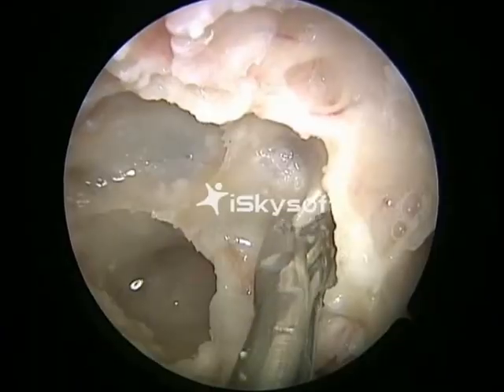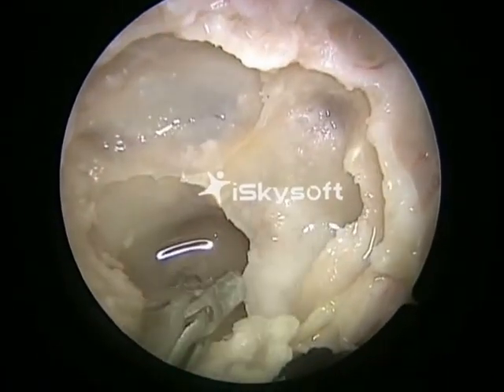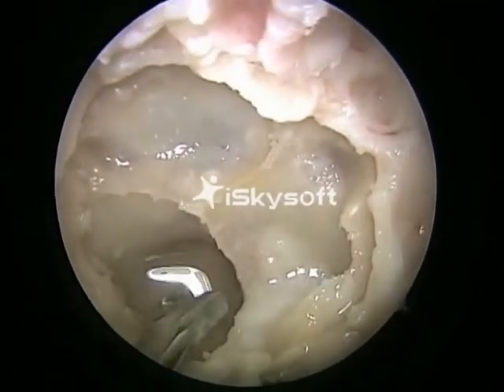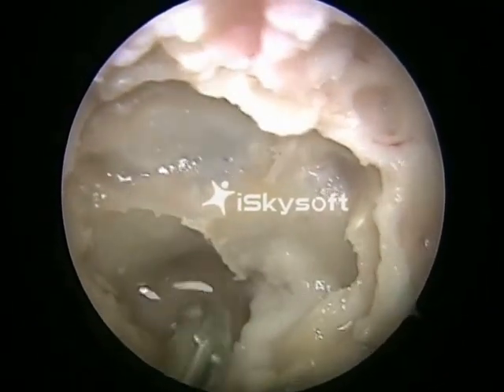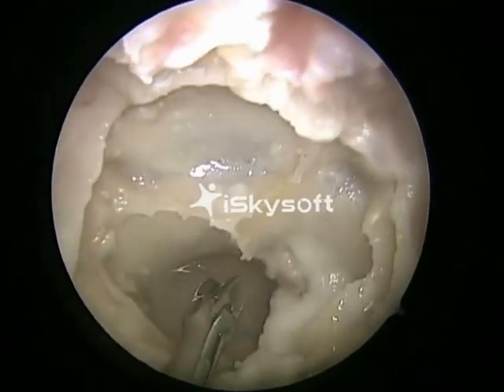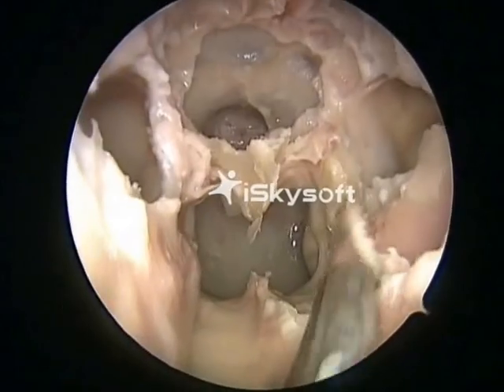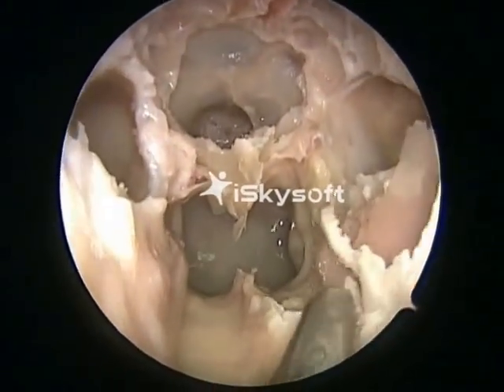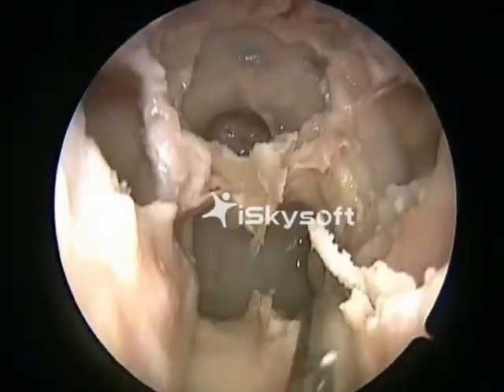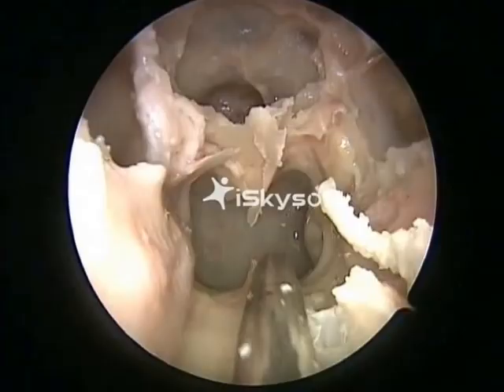so that it doesn't shear the bone out. Now we can have a very clear view of the nasopharynx, and we are debriding away the nasal septum till the floor.